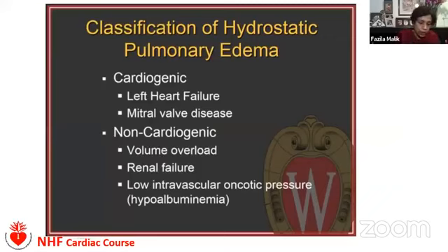So once the patient develops increased pulmonary venous pressure, there is a chance that the patient might end up with pulmonary edema in case of mitral stenosis. So in mitral stenosis, we get certain findings due to the enlargement of the left atrium. We get certain findings due to the enlargement of the right ventricle and the right atrium. And we also get certain features in the lung field. So we're getting some findings in the heart, and we're getting certain findings in the lungs which are happening there because of pulmonary edema.